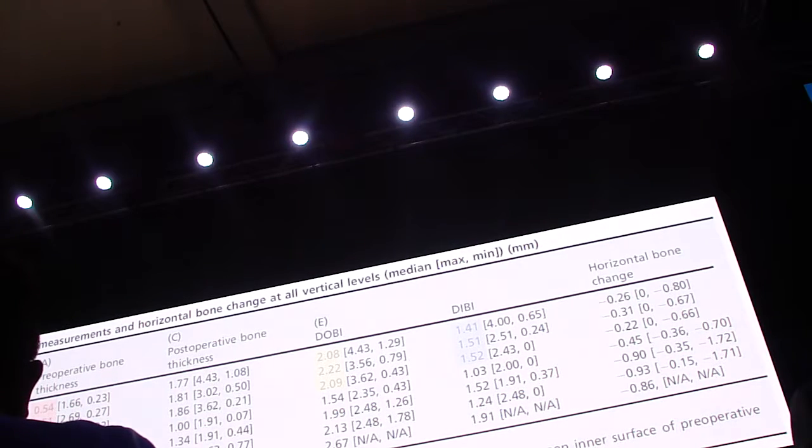Now in the post-operative x-rays they took, 3-dimensional x-rays, this is the green column, they ended up with 1.8 millimeter. So it tells us they had 2 millimeters, 1.5 of it was jumping distance, and they ended up with 1.8, so basically they didn't lose a whole lot. Maybe a little bit due to bundle bone resorption, but overall it was preserved well. So what did they do in that study?